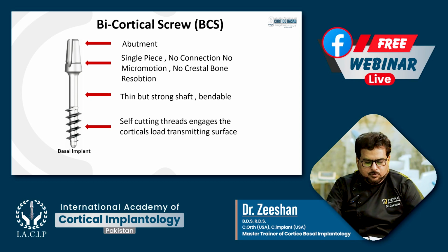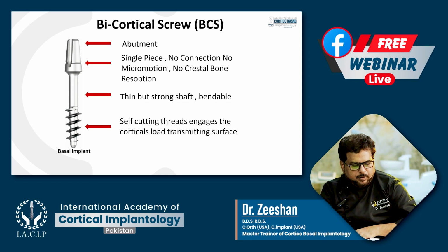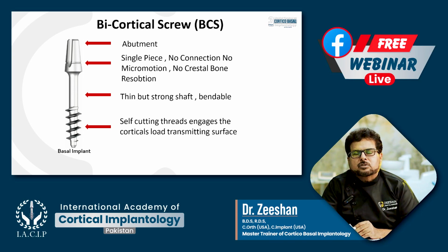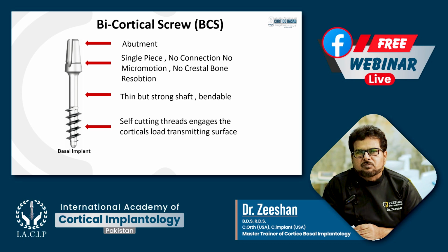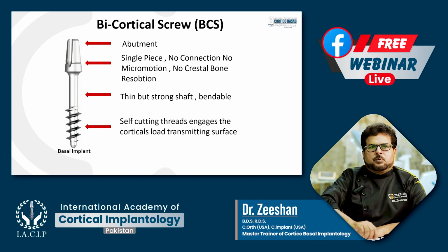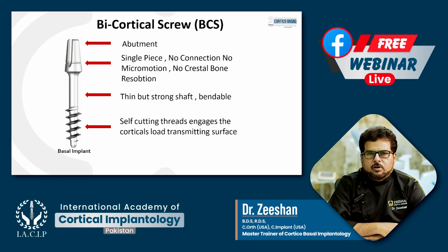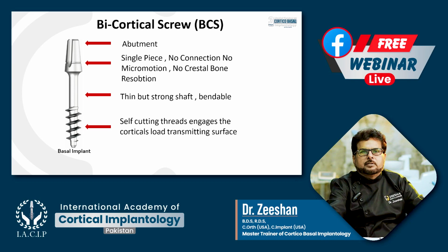A lot of advantages are there for providing the immediate loading with the basal implant, such as fewer surgeries, less invasive procedures, just one drill, and you are engaging your implant. Post-operatively, there are fewer complaints, so you don't have to worry about your patient because of less invasive surgery, and bone grafting is not required.